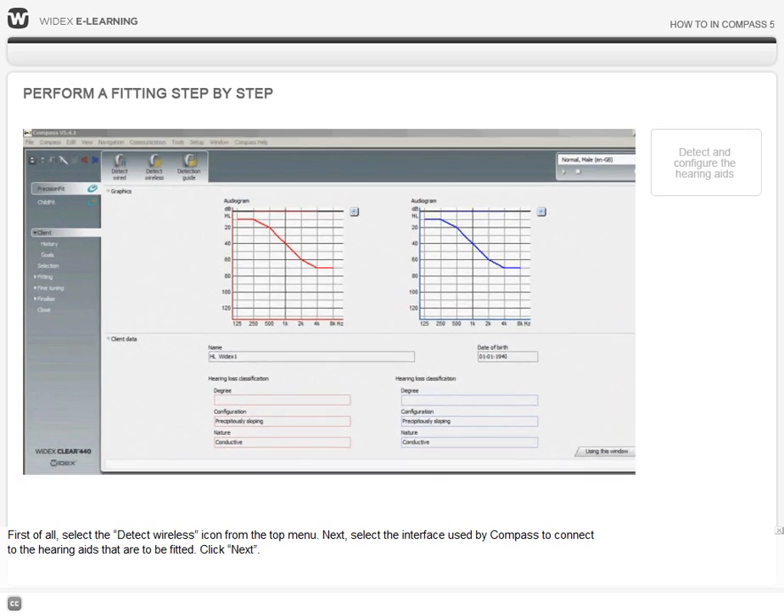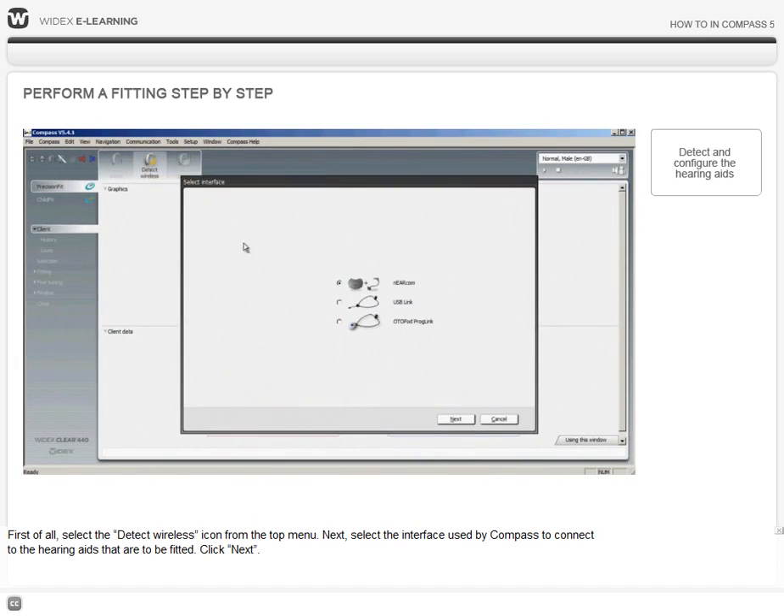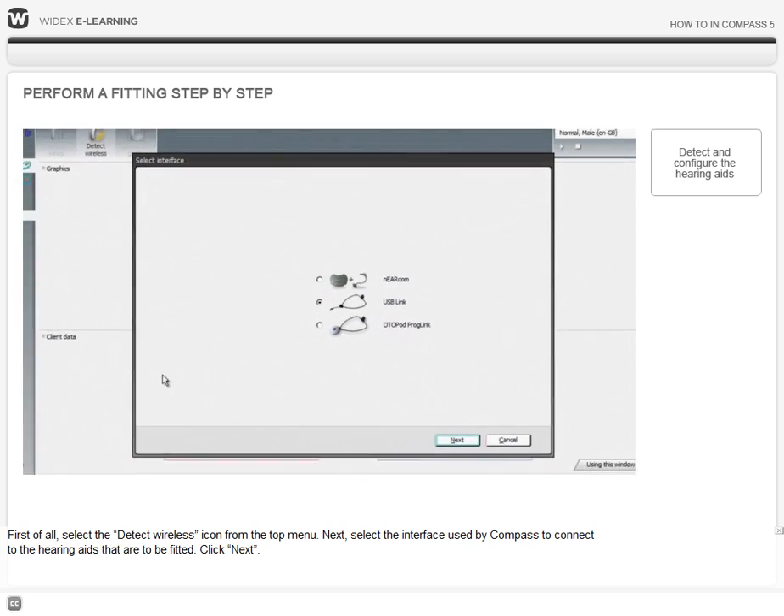First of all, select the Detect Wireless icon from the top menu. Next, select the interface used by Compass to connect to the hearing aids that are to be fitted. Click Next.